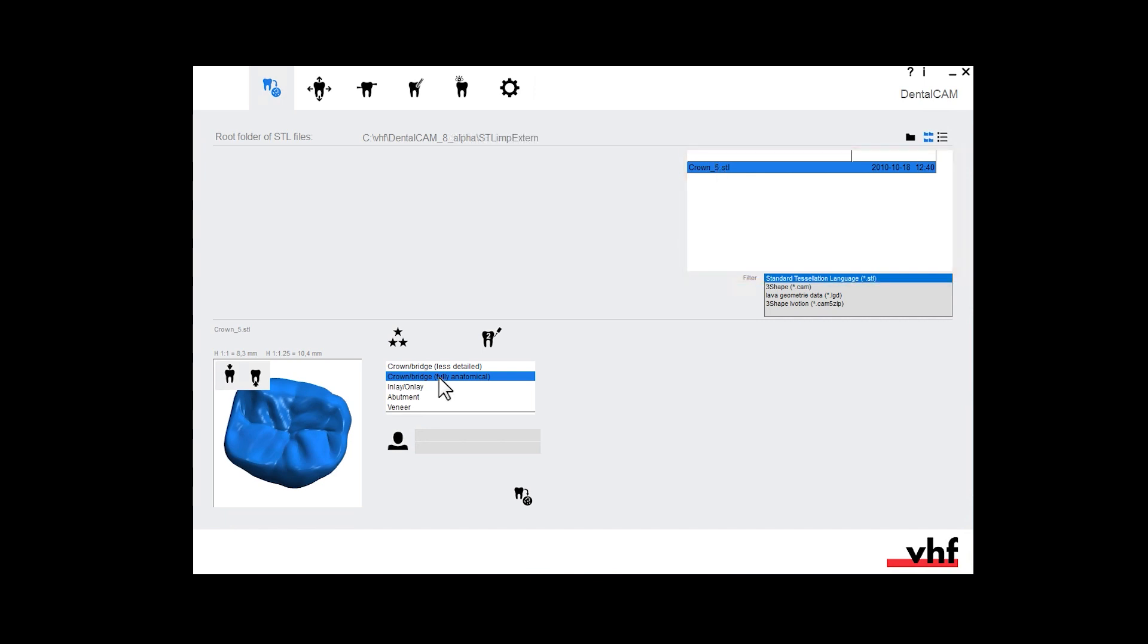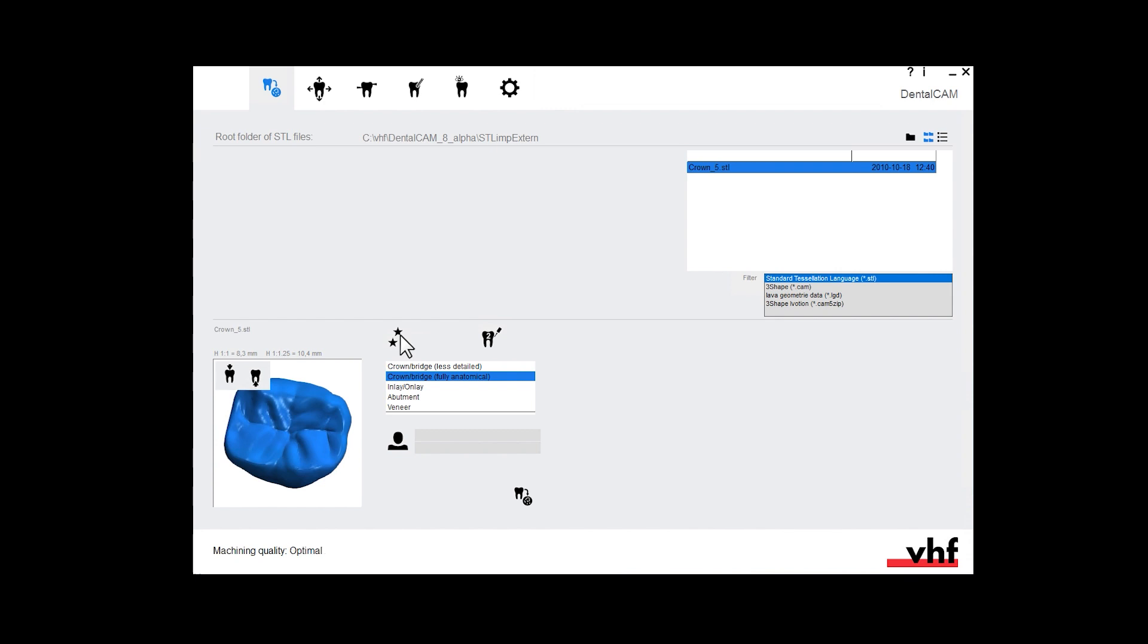Specify the calculation options. First, select the indication from the list. In this case the object is a crown, so we select the entry crown bridge fully anatomical. Then select the machining quality by cycling through the icons. A higher machining quality results in finer outer surfaces but also in a higher machining time. Optionally, you can enter patient information into these two input fields. Add the object to the job.